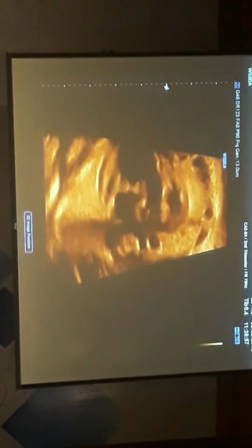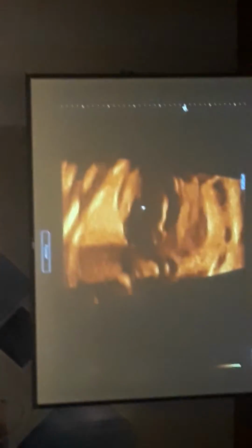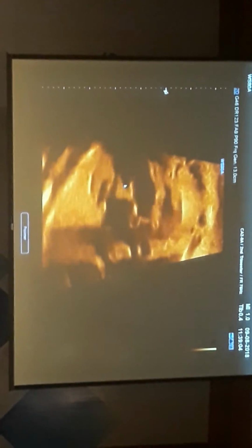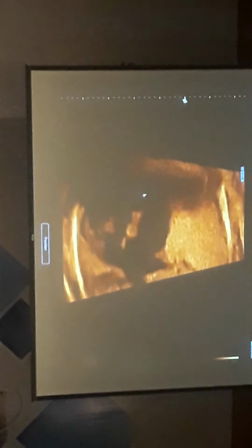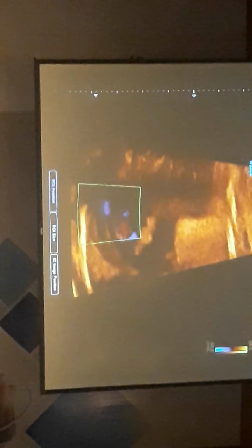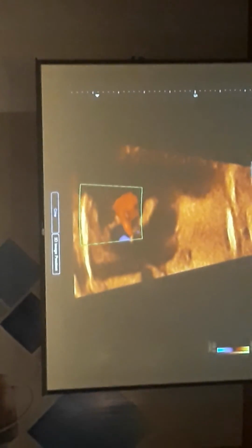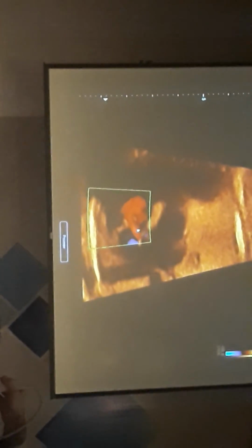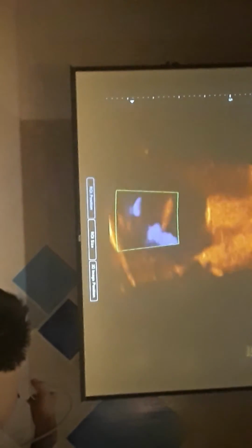So I think, one thing I forgot to do, I need to make sure this mitral valve does not have a lot of regurgitation. So for that, I'll come over here. It's tough, I could try, it's not the best. I think there probably is some regurgitation here, but it doesn't look severe.